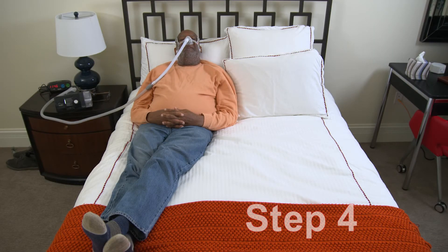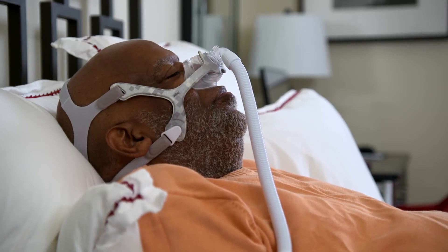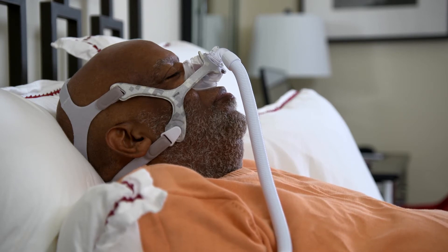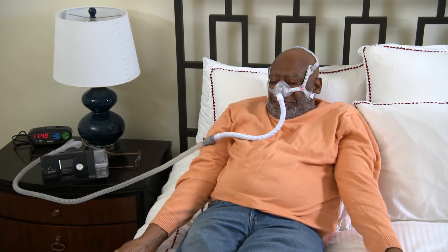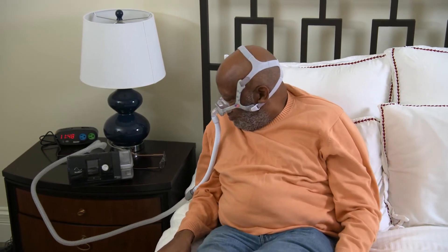Step 4. As you continue to wear your mask for an hour or two each day, while doing something you find relaxing and enjoyable — perhaps lying down or reclining in your favorite chair — let yourself drift off for a daytime nap: your first real PAP sleep experience. Continue with Step 4 until you feel comfortable and confident with napping while wearing your mask. If you're trying to avoid naps, however, you can skip Step 4.